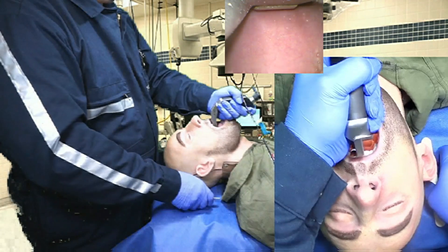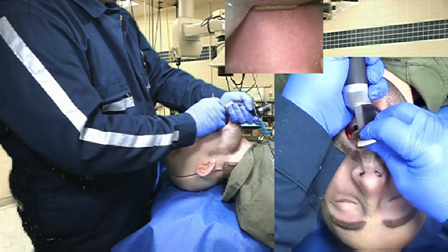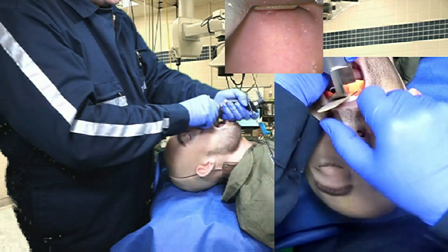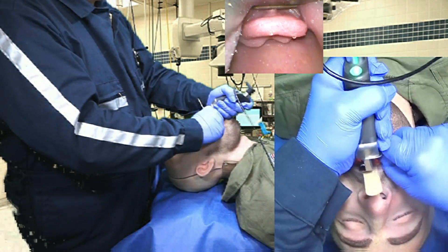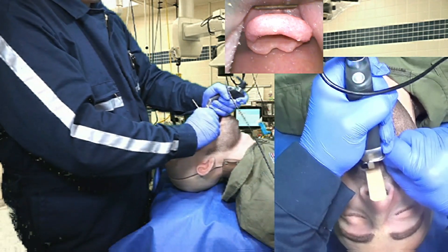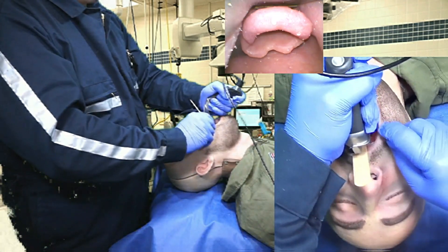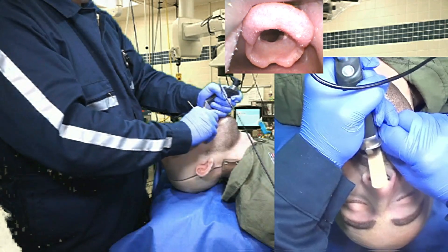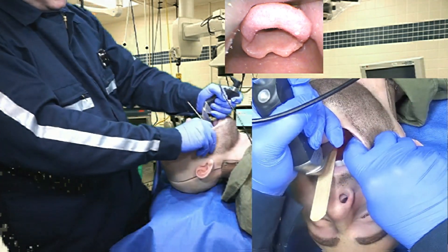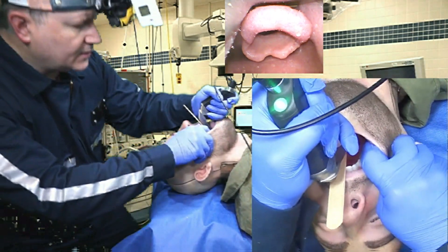I see the tip of the epiglottis. I'm resting also on the upper dentition, so I'll put the tongue depressor between the upper dentition and the laryngoscope itself. I'm going to bring that around the base of the tongue, use that salad pinch method, and I'm getting an exposure of the larynx. This salad pinch is really helping me get a grade 1 view on direct laryngoscopy.